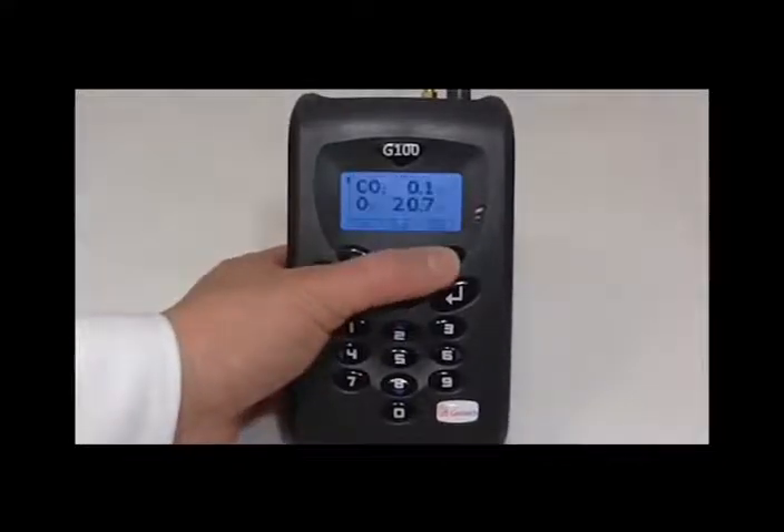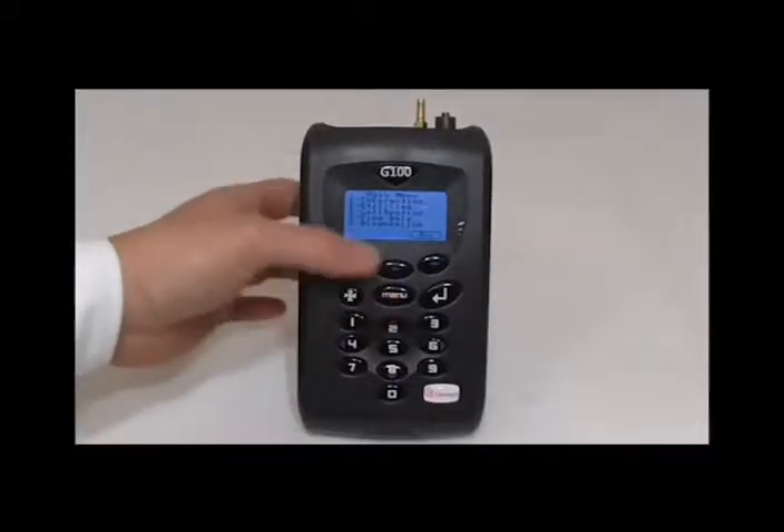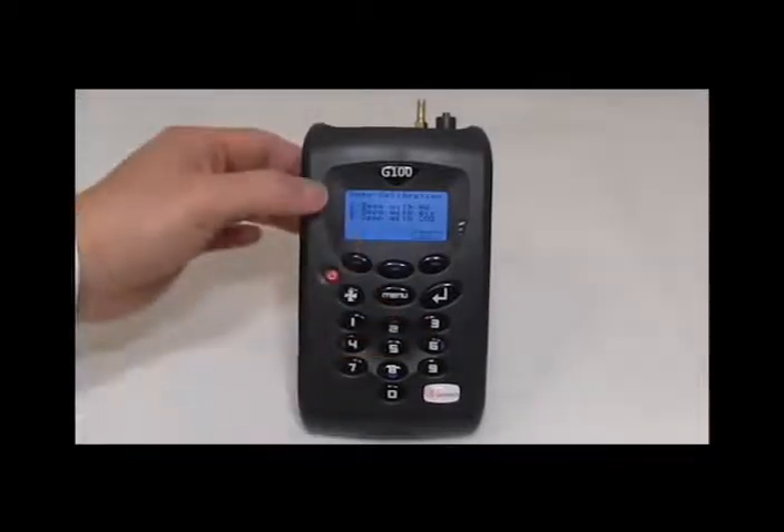Once you have adjusted the flow fail point, the next step will be to zero calibrate the instrument. This is probably the most important step. Press the menu key, then 3 for calibration. We will calibrate the carbon dioxide first, so key 2 for the CO2 channel.